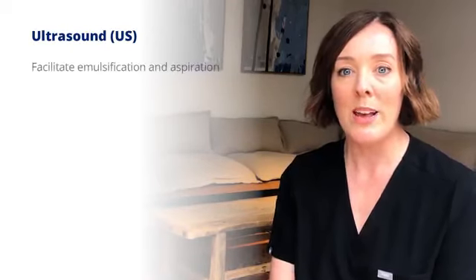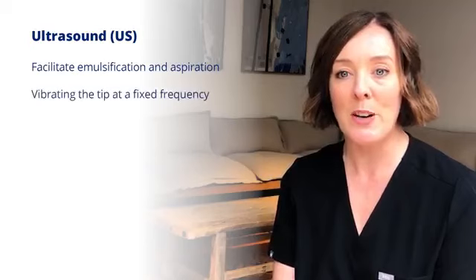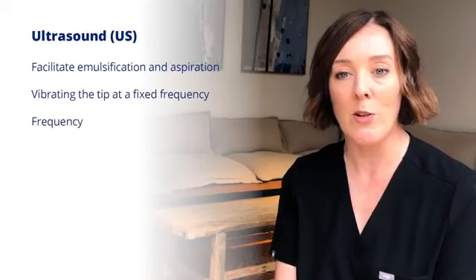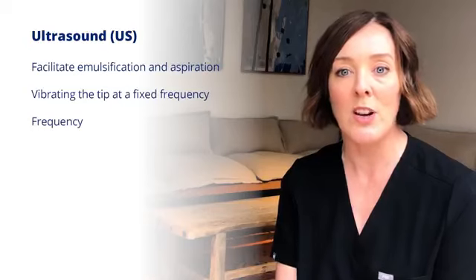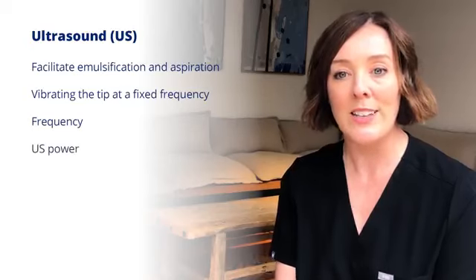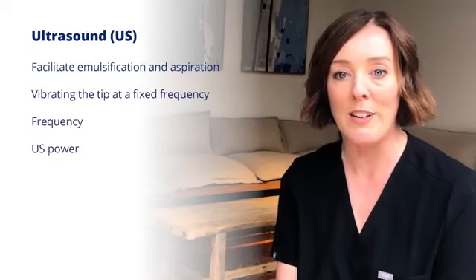Phaco machines deliver ultrasound energy into the eye to break up the cataract to facilitate emulsification and aspiration. It does this by vibrating the tip at a fixed frequency when the foot pedal is in position 3. Frequency relates to how fast the phaco tip oscillates back and forth. Usually between 27,000 and 60,000 strokes per second is efficient for nuclear emulsification. The lower the frequency, the less efficient the ultrasound will be. The higher the frequency, the more heat will be generated. Ultrasound power is calculated by the frequency of tip movement plus the stroke length, which is the distance the tip moves back and forth.